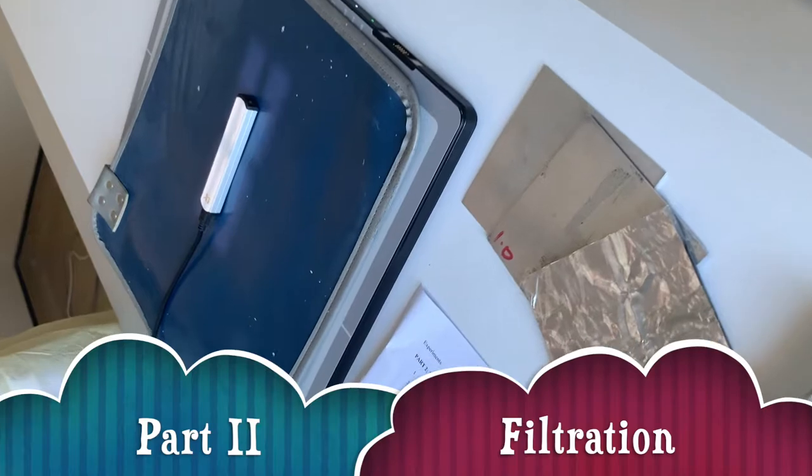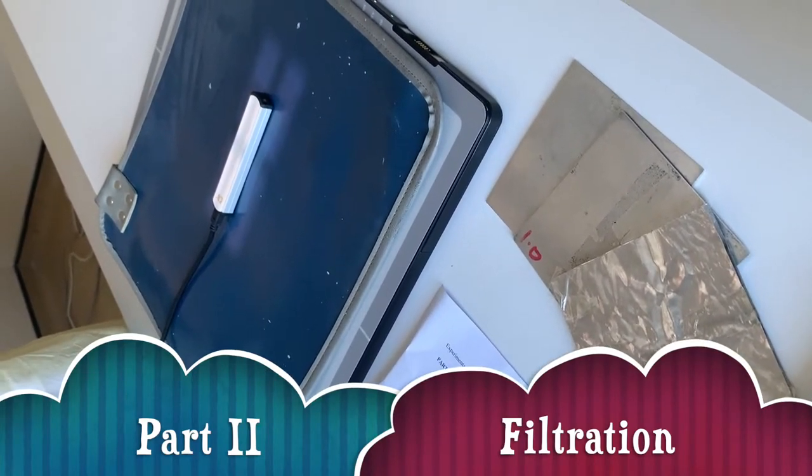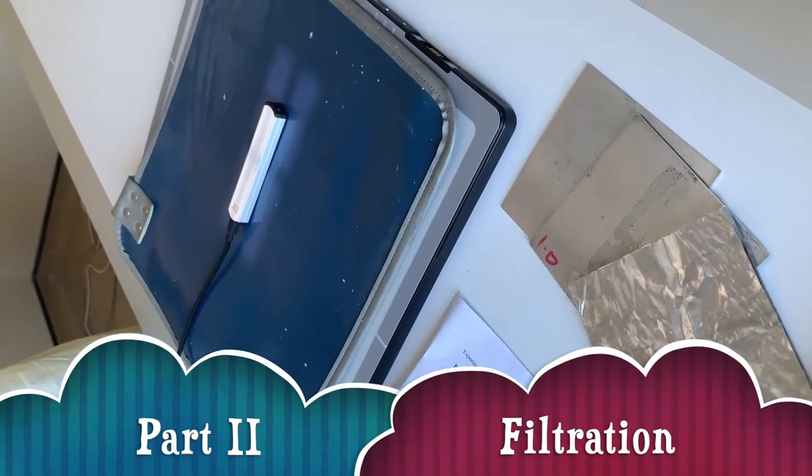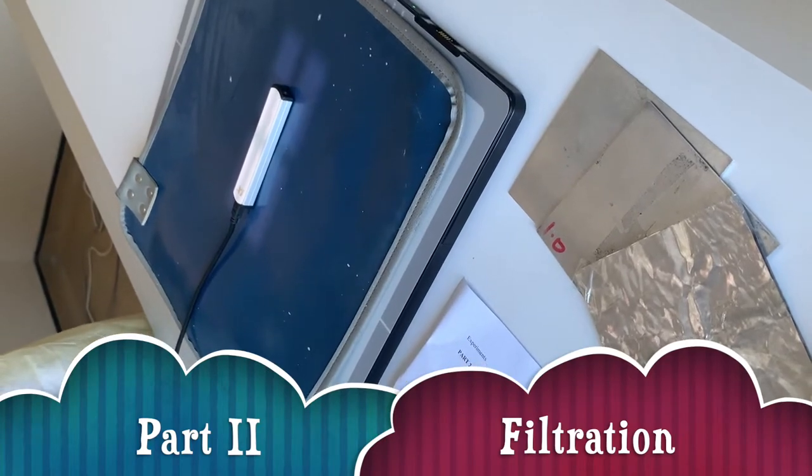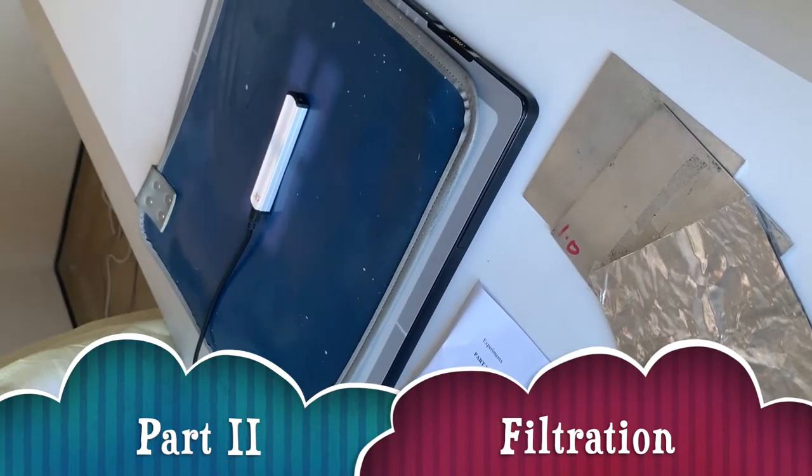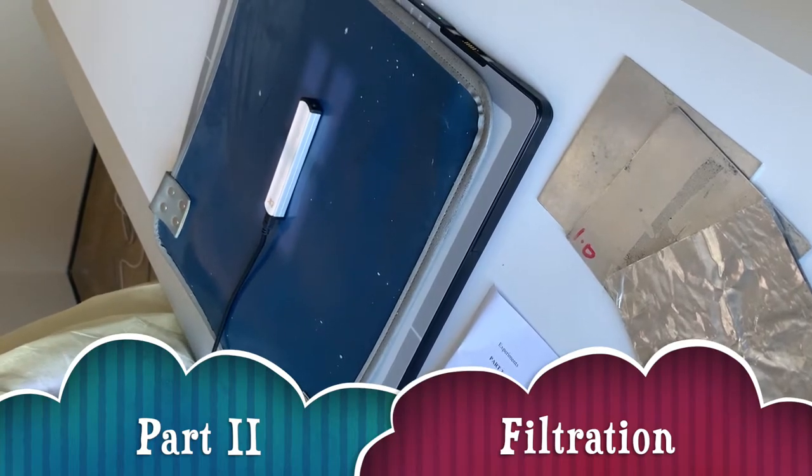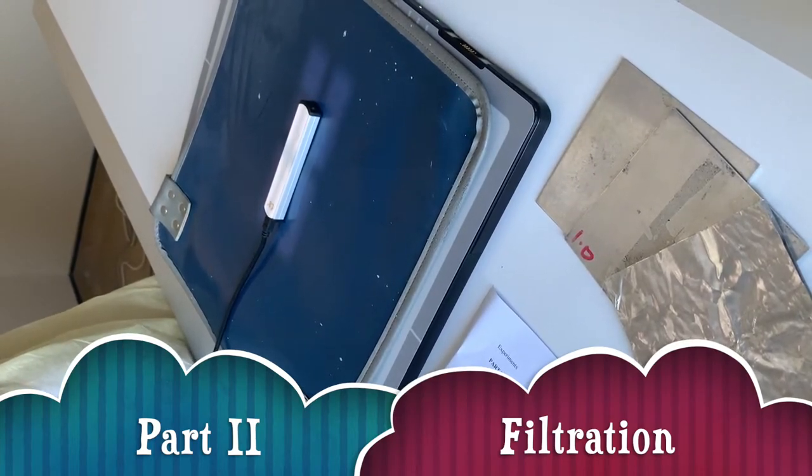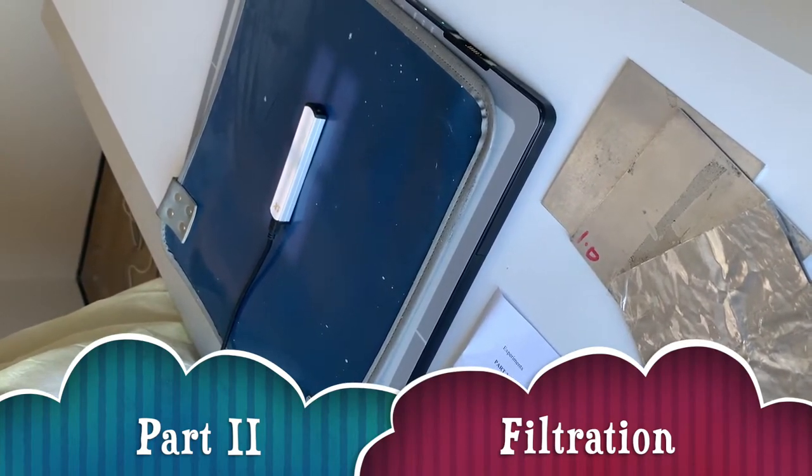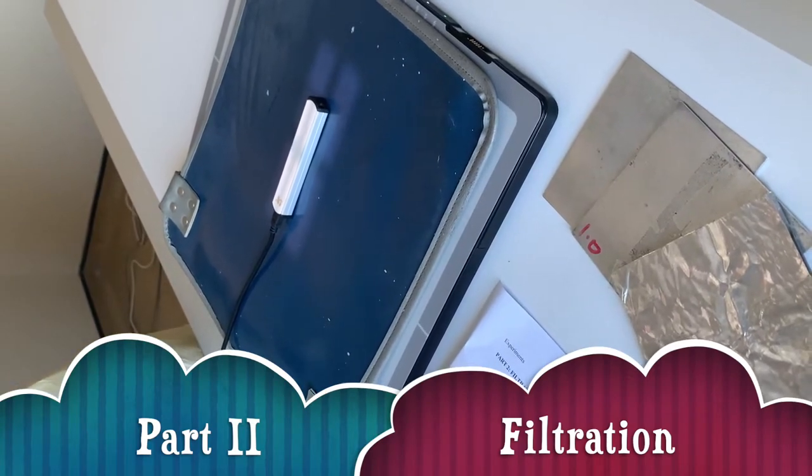After we've measured our half value layer, we are doing part two of this experiment, which is filtration. This is to check that the value measured is exactly the same as the one provided by the manufacturer of the machine written on the X-ray tube.